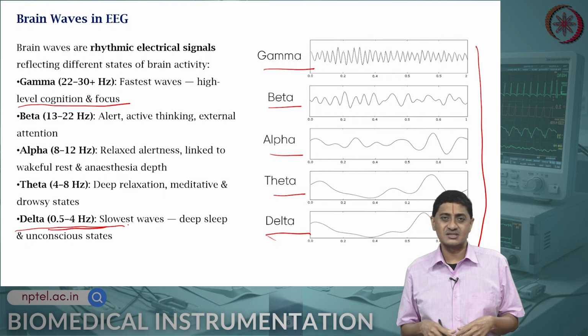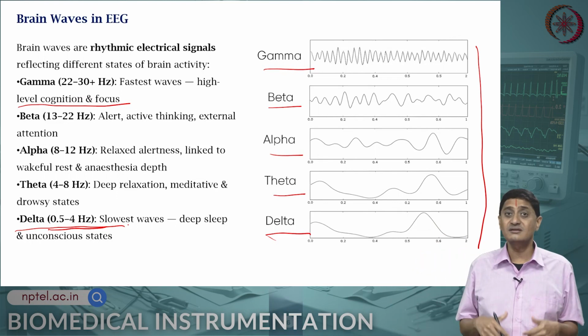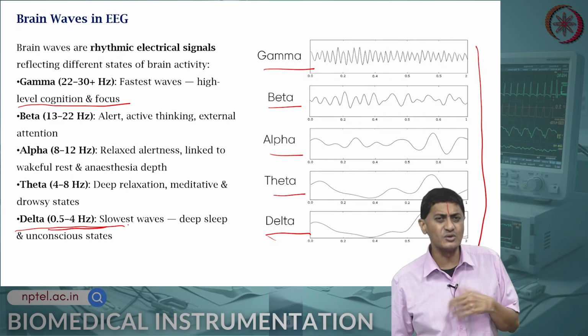The amplitudes and the frequencies might be comparable. How will you then filter this out? Those are practical challenges. We discussed some of this in the previous set of videos. We will continue our discussion.